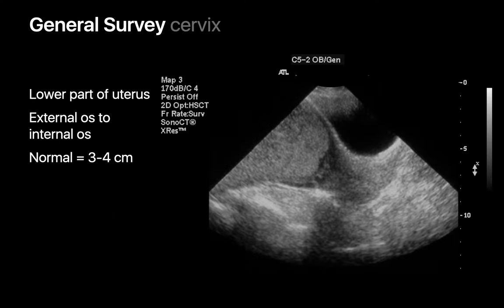The general survey begins with an assessment of the cervix — the lower portion of the uterus. We carefully inspect it from the external os to the internal os and measure the length of the cervix, which should normally be around three to four centimeters.